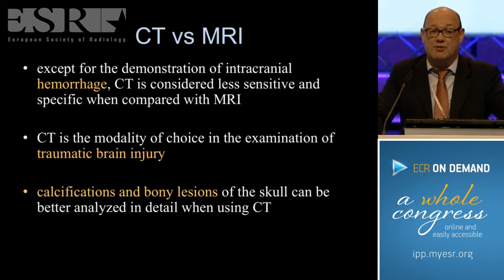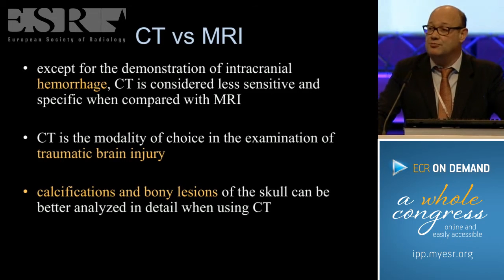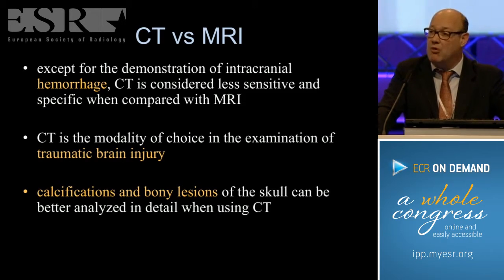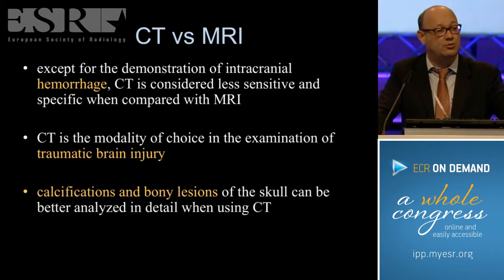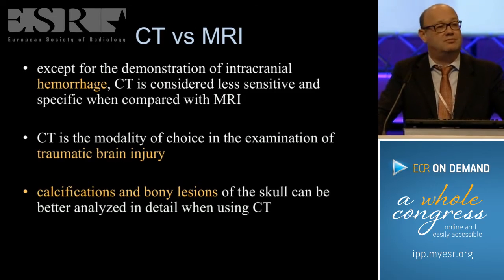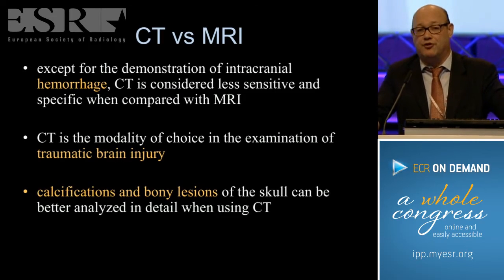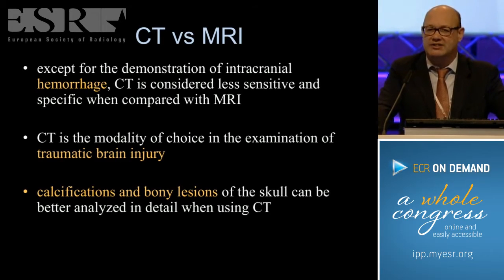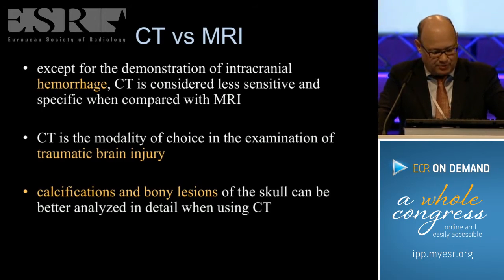CT versus MR. The next presenter, Professor Daniela Preyer, will go with you into detail on things that can be mistaken on MR imaging. I will deal with you on CT imaging. I think most of you, if you would have the choice to perform CT or MR, would say, yeah, MR is definitely better, it's more sensitive, you have more possibilities compared with CT.